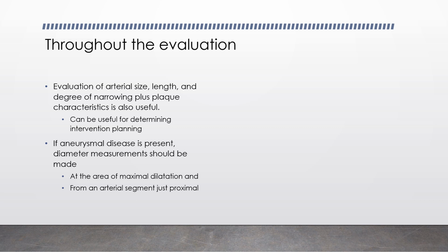If you find an aneurysm, make sure that you are evaluating it thoroughly. So just like we would do an abdominal aneurysm in somebody's abdomen, that's very common, we're going to want to make sure that we're evaluating it in long B mode, transverse B mode, and then we're going to have to evaluate it in transverse proximal to, at, and distal to.